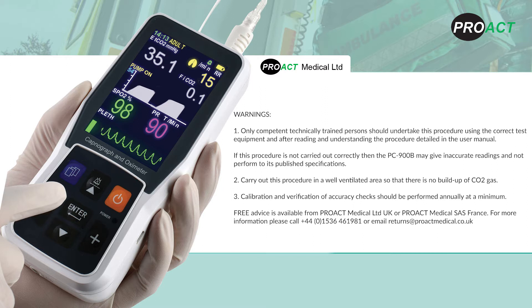Carry out this procedure in a well-ventilated area so that there is no build-up of CO2 gas. Calibration and verification of accuracy checks should be performed annually at a minimum. Free advice is available from Proact Medical Limited UK or Proact Medical SAS France. Please call 01536 461 981 or email returns at proactmedical.co.uk.